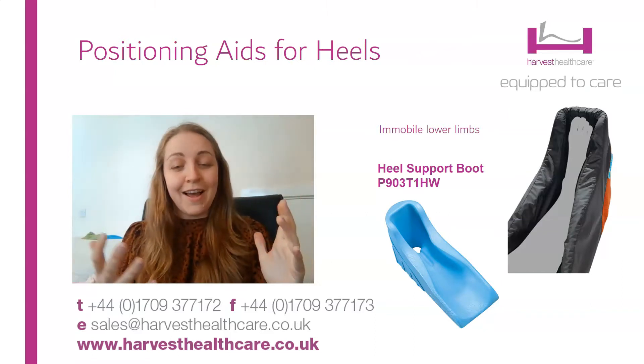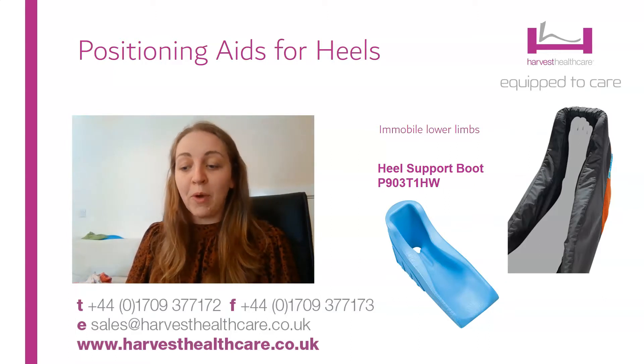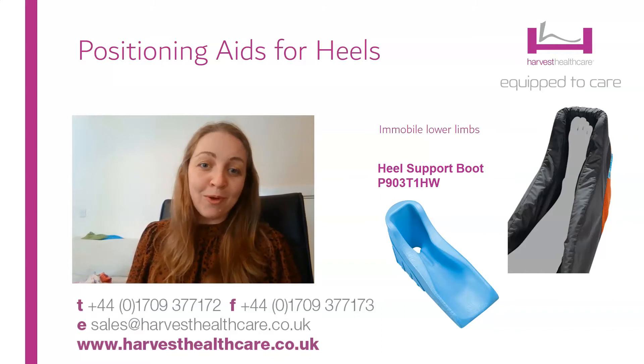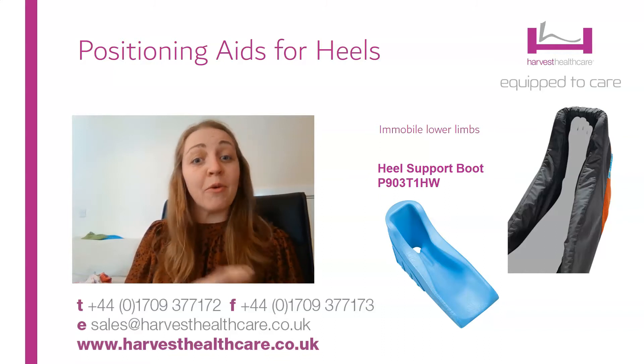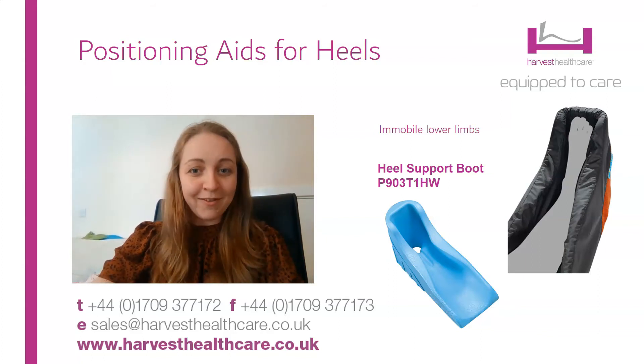That's the whole range. I think you'll agree that it's very helpful to have access to these kind of products to help people who have got vulnerable heels. If you have any questions about anything in the range, you can always contact us at Harvest Healthcare either through our customer service or through your local sales rep. Hope this was helpful for you — have a lovely day.